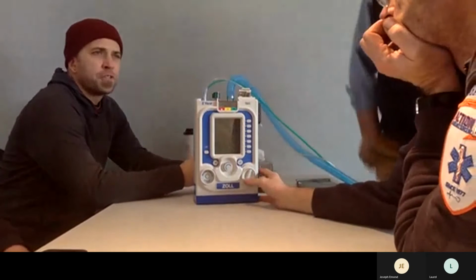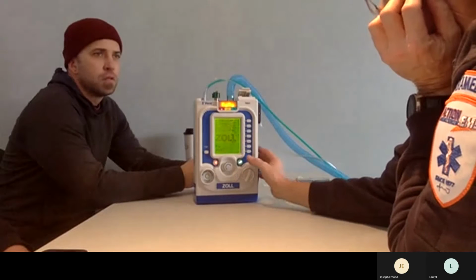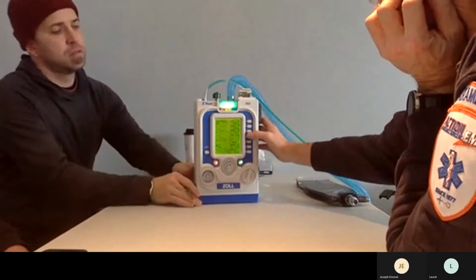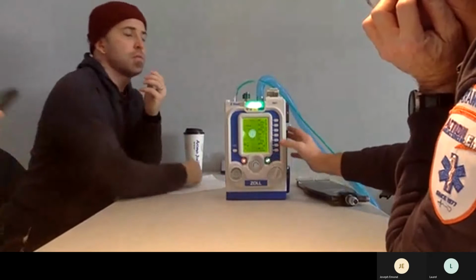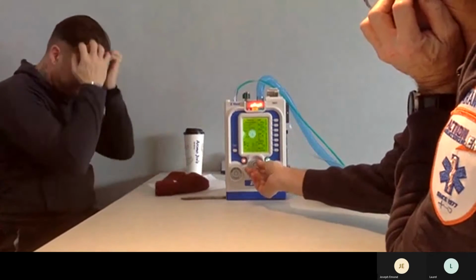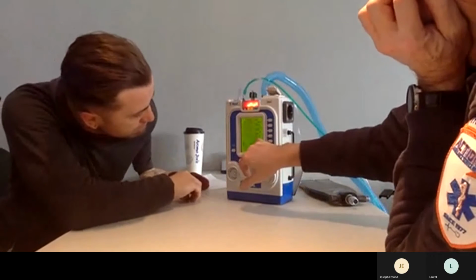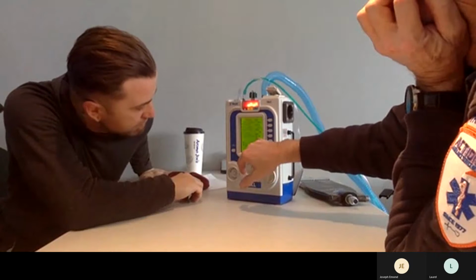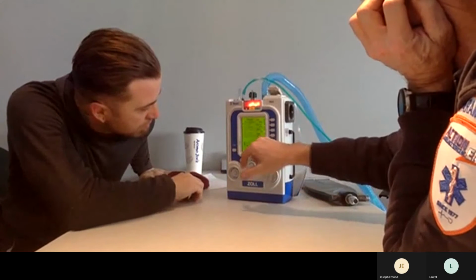It's the 10/5. CPAP with pressure support, but we're using the same mask. It's a non-vented mask. Between CPAP and BiPAP, it's the same mask. So I have a PEEP of 5, and we're going to add 5 to the CPAP of 5, right?